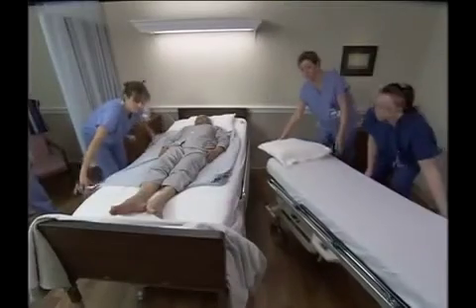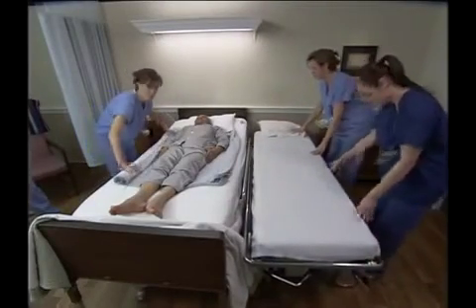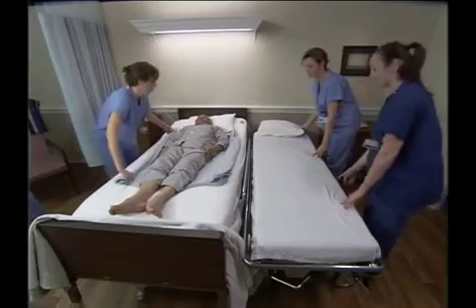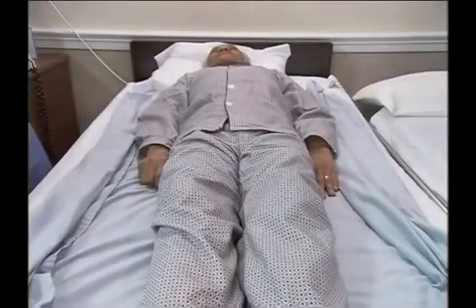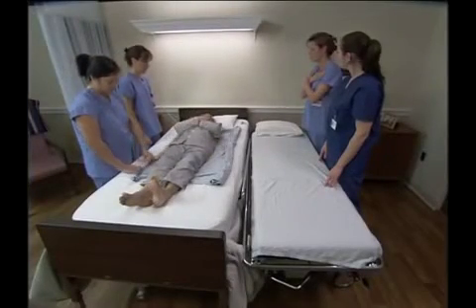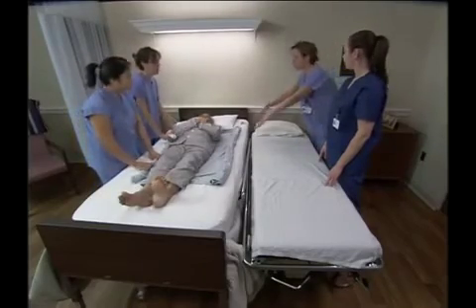Position the stretcher alongside the bed. It should be slightly lower than the bed. Lock the stretcher wheels. If stretcher safety belts are in use, move them out of the way. Make sure the lift sheet is positioned so that it is under the person's shoulders and hips. As shown here, 2 assistants stand on one side of the bed facing their co-workers, who are positioned along the outside edge of the stretcher.